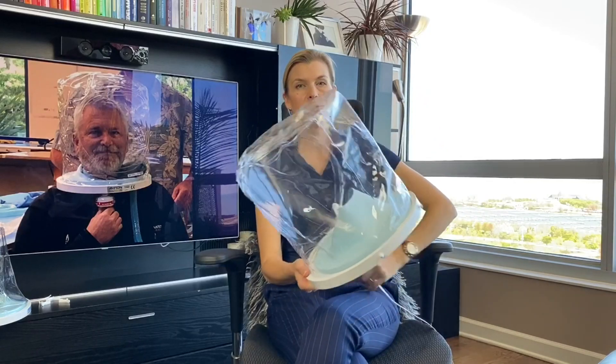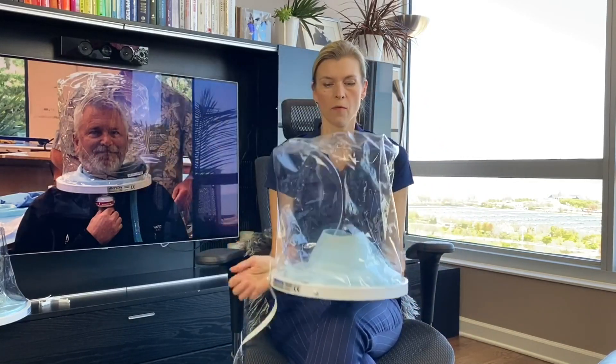Hello, my name is Audika Savitskaya. I'm a co-founder of HelmetBasedVentilation.com. I received a helmet from Amron International, and that's a new design that is for the non-invasive ventilation use.